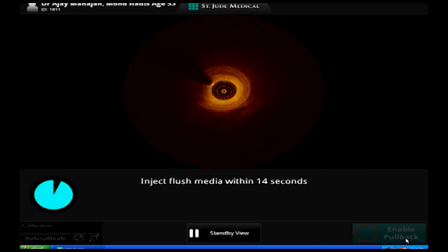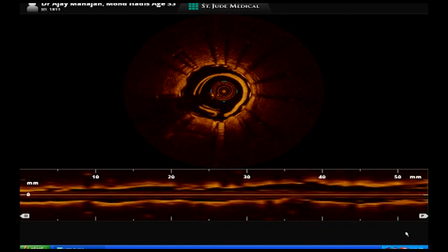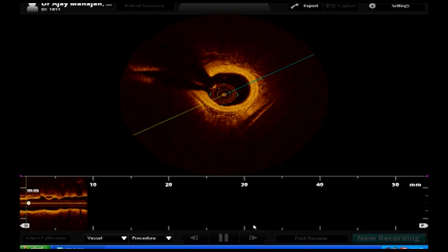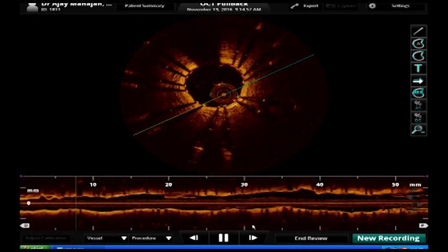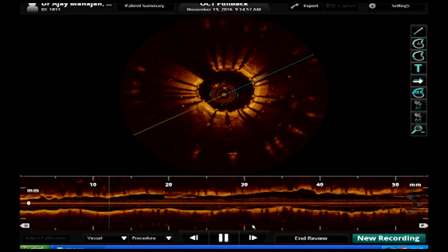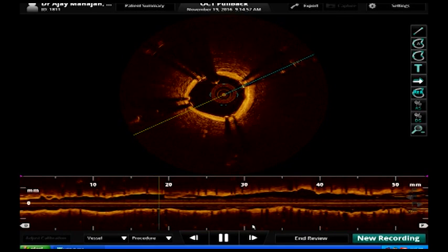It's interesting what you said, if I may, about the IVUS. 99% of IVUS, I understand in the proximal LAD or left main disease, because marginal branch or diagonals or something like that is not necessary. Why I use 99%? I don't pay for it. I understand Ramesh said it's not reimbursed, but I don't pay for the catheter. My hospital allows me. It cut my procedure time in half. This case would have been done by now.